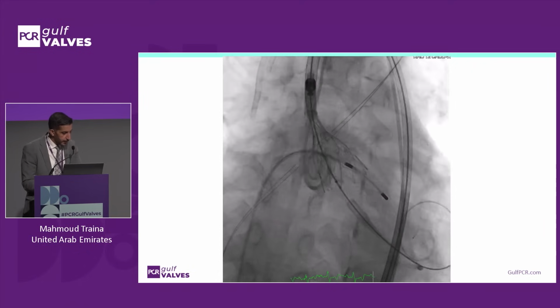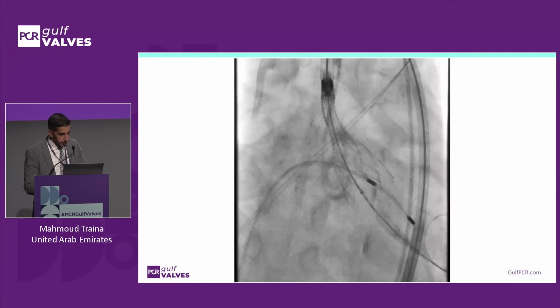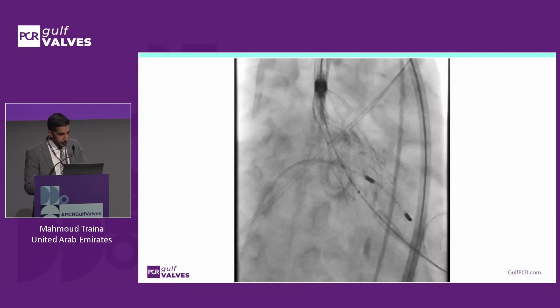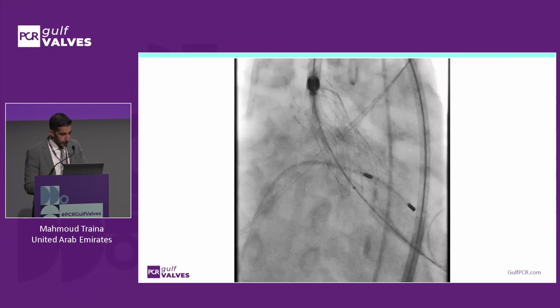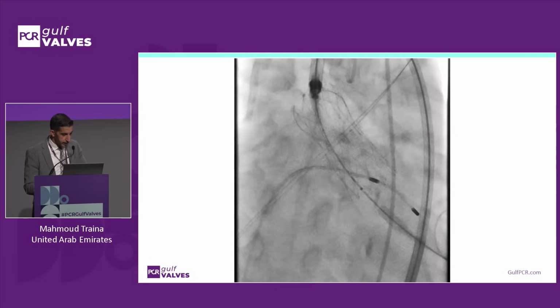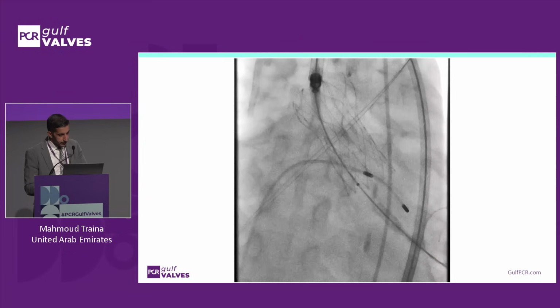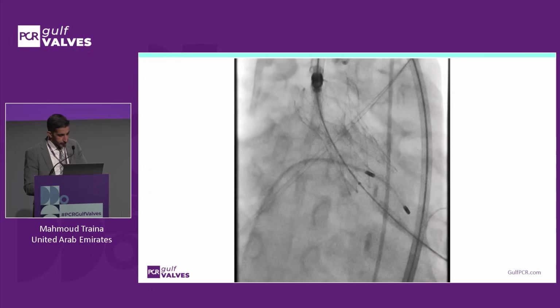Okay, nice height, about 3 to 5 as you'd like. Then here's the release, just a nice steady release. Picks up on the left side, stays stable on the non-coronary side. And pretty smooth.